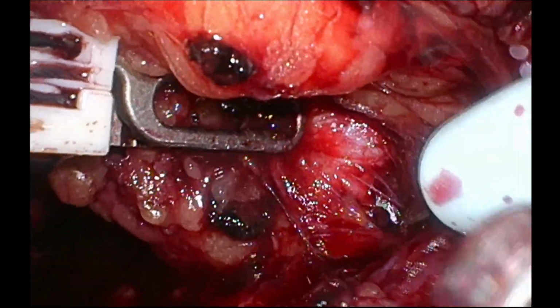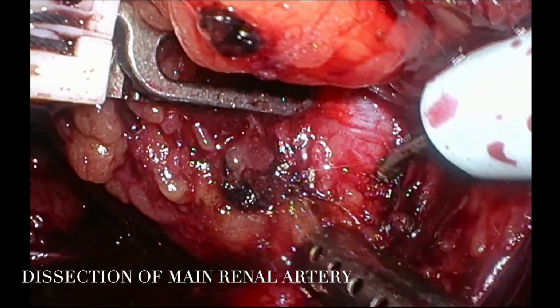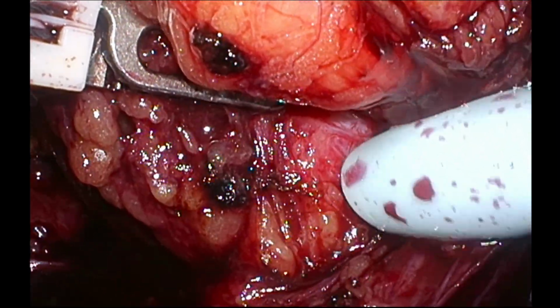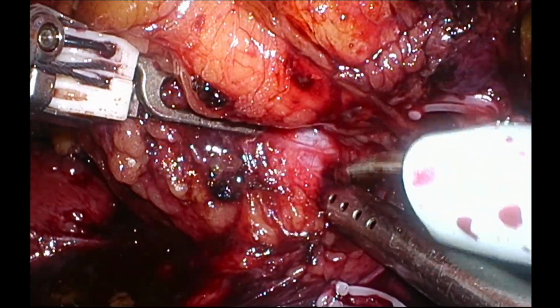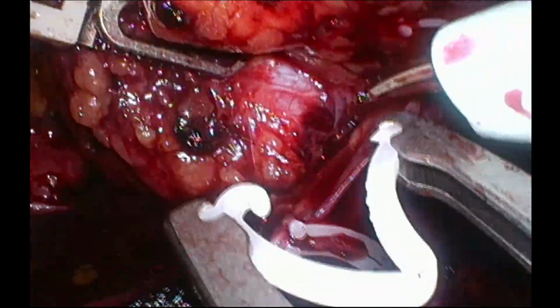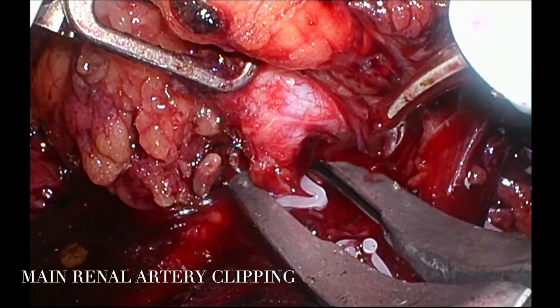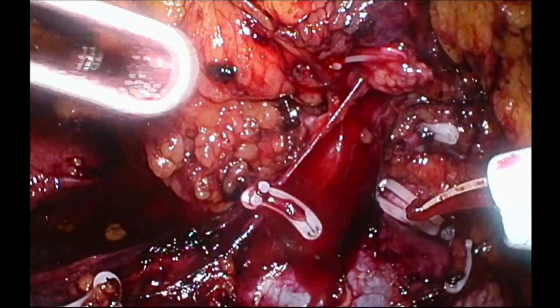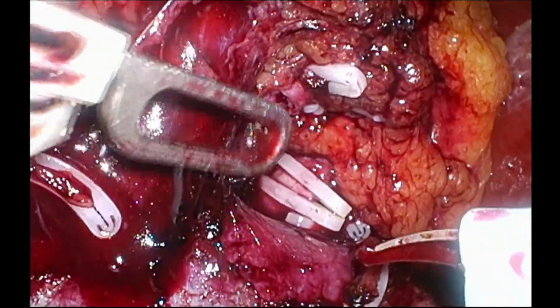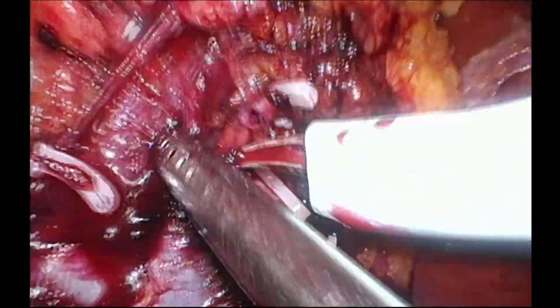On the right side, renal artery remains posterior to the renal vein. Sometimes it is difficult to dissect entire length of the renal artery. As the renal artery is not adequately dissected in appropriate length to apply all the hemolock clips, one clip is applied across the renal artery. Clamping the renal artery shuts down all the vascular inflow towards the kidney. This allows dealing with the renal vein.